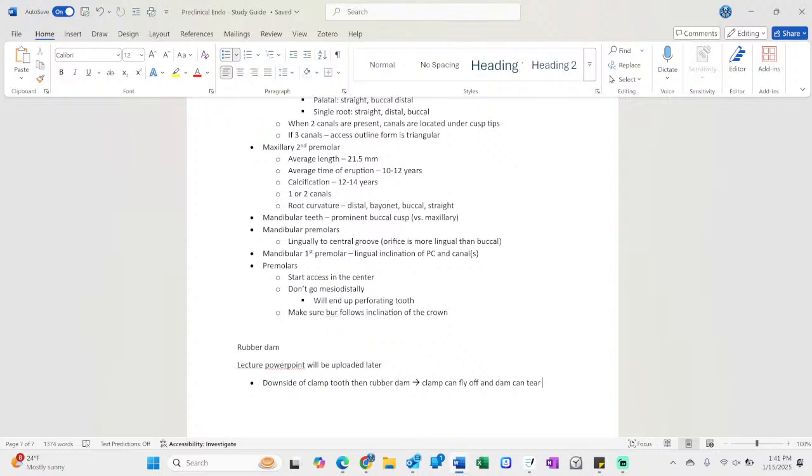So yeah, this is for the anterior here. So this is before placing, so you can see how the rubber dam is going over those wings, and then after placing, and then what we do next, we go in and floss this to make sure that it's all done.